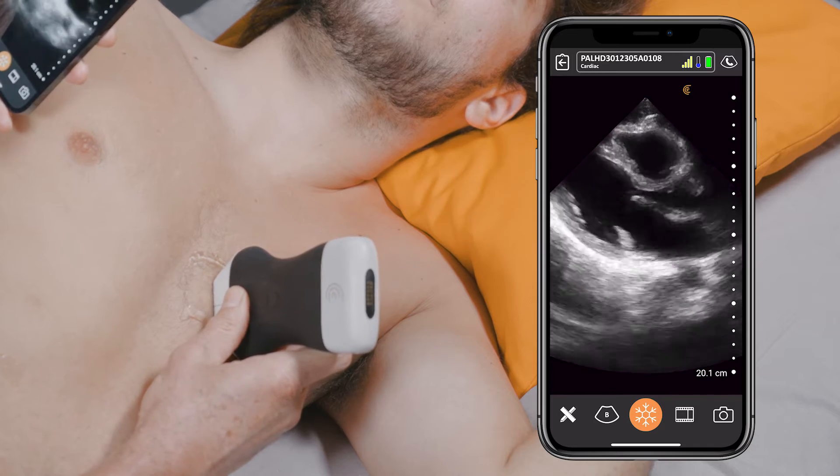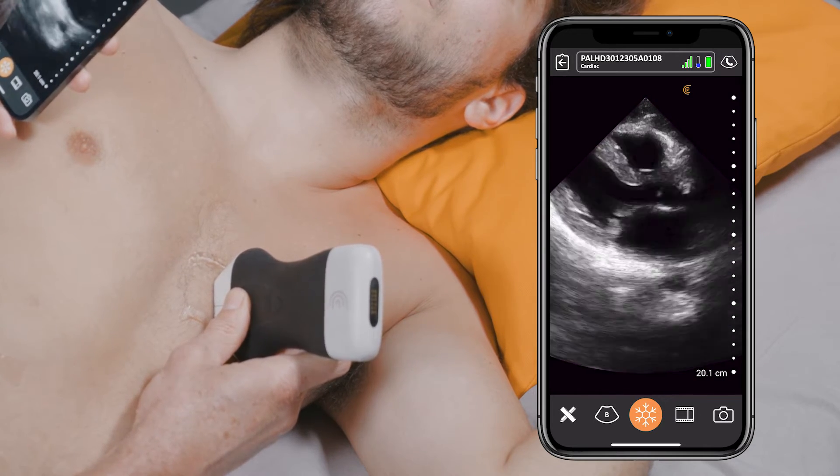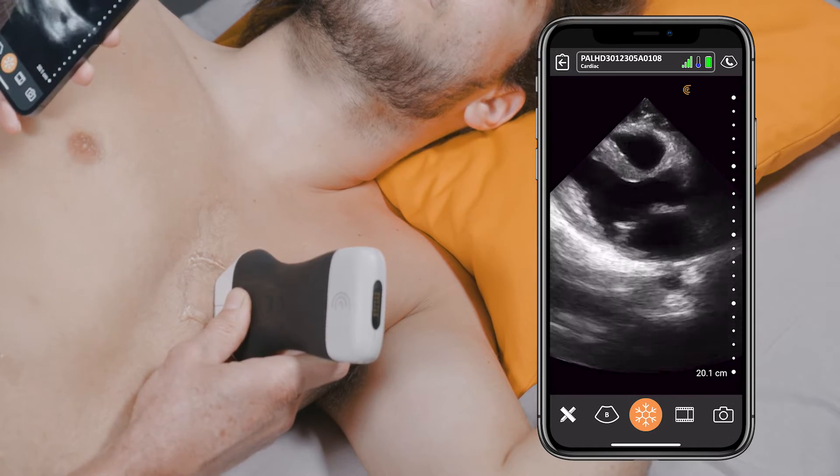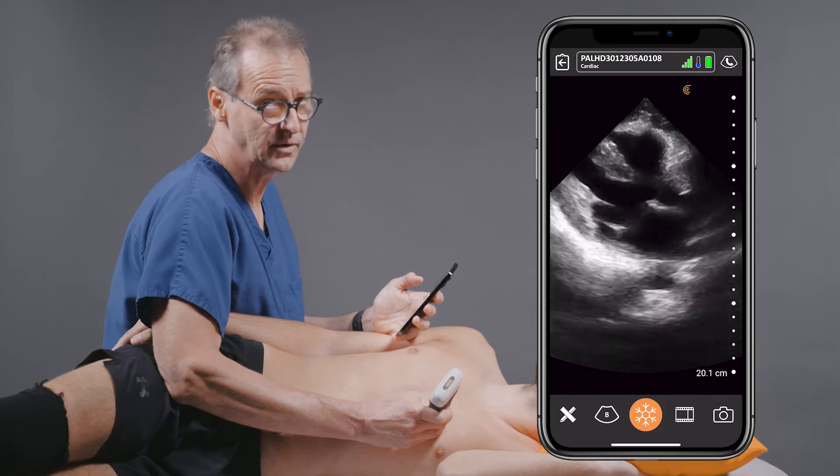The image quality is really fantastic. You get a great view of the left ventricle, right ventricle, mitral valve, aortic valve, and even the descending aorta just deep to the left atrium.